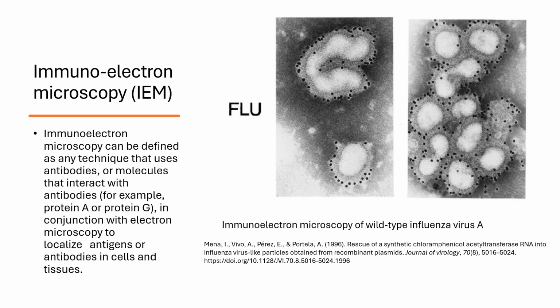The grid is examined under an electron microscope. The electron-dense markers make the virus particles visible, allowing researchers to identify their location and morphology, shape, and size. This is an immunoelectron microscopic image of wild-type influenza virus.